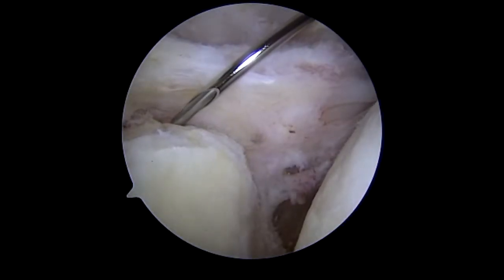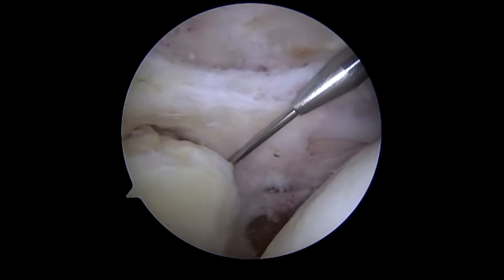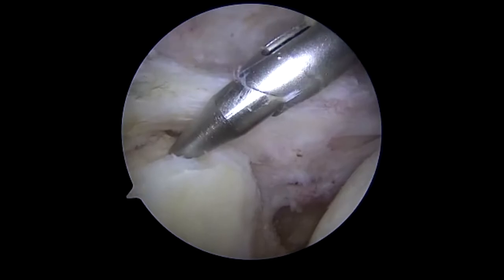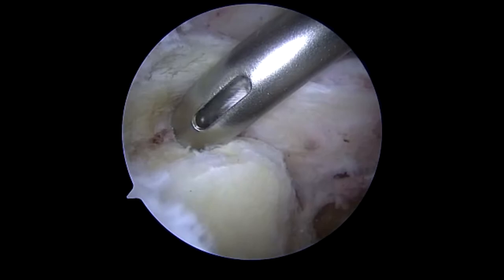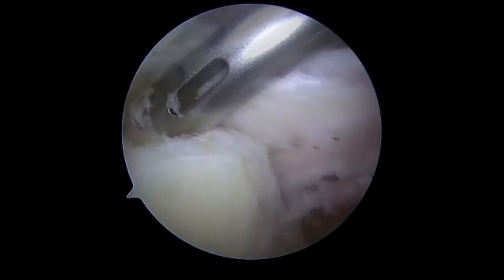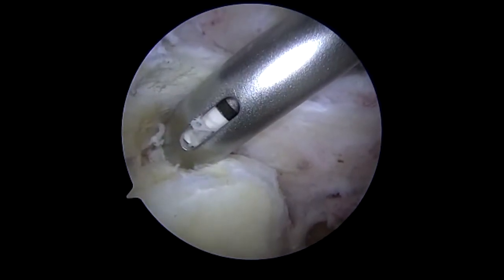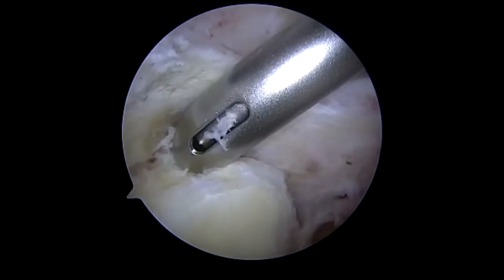We are now preparing for anchor placement. Here we place the guide wire where we will overdrill, and that will be for the placement of the 3.9 mm biocomposite knotless corkscrews that will go in the superior glenoid rim, or more so the neck, in preparation for the attachment of the most medial aspect of the dermal graft.